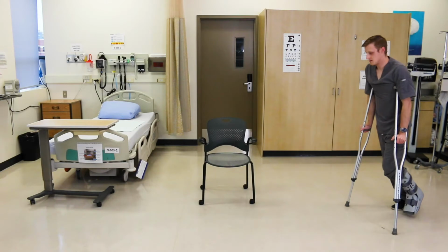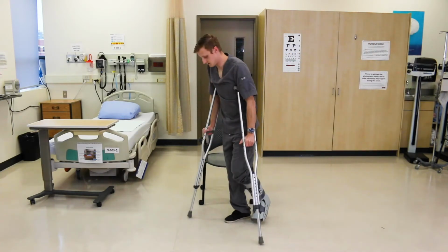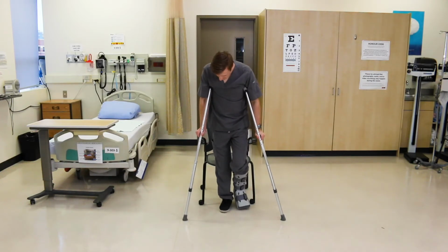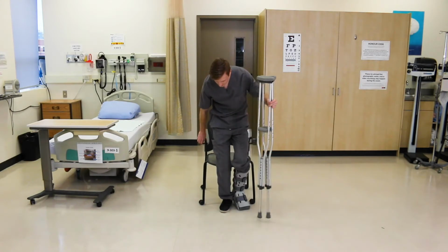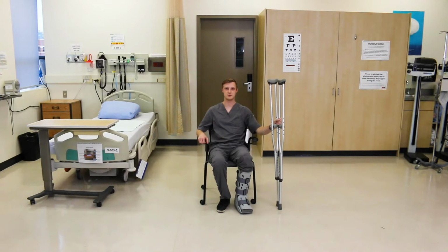When you are going to sit in a chair, make sure you can visualize where you are going to sit and have the back of the leg touch the edge of the chair. Hold both crutches in one hand, place a hand on the armchair, and slowly sit down.